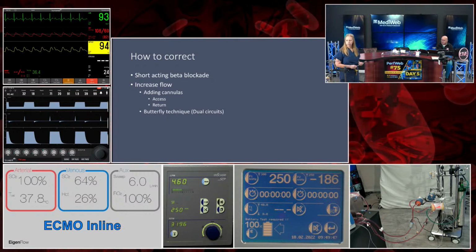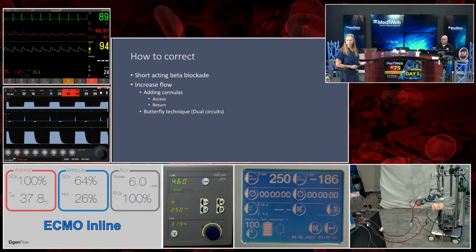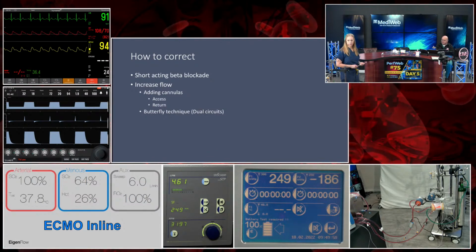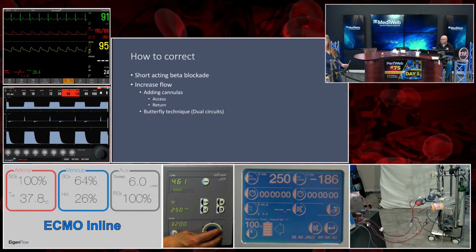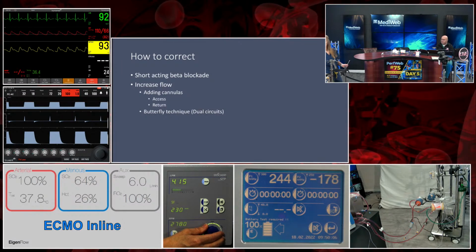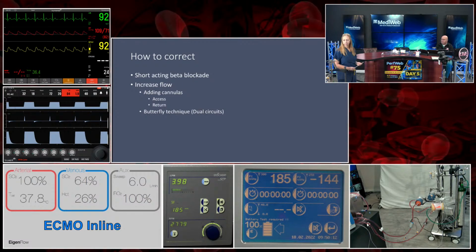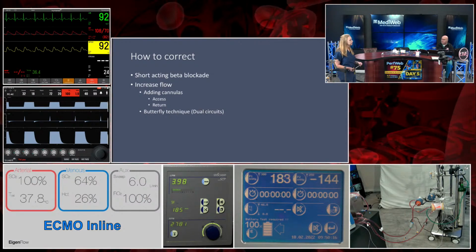We've done the esmolol, and you see the patient monitor has gotten much, much better. Your SATs are up to 94. And for the rest of this ECMO shift, you can turn your flows down a little bit so you don't have such high pressures and reduce cellular damage from the red cell destruction caused by the higher negative pressure. Your CRRT machine is probably going to work a lot better now that you don't have as hostile an environment.